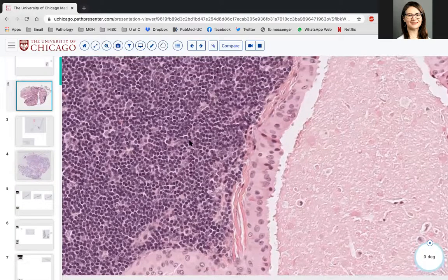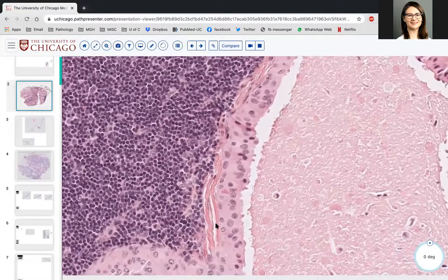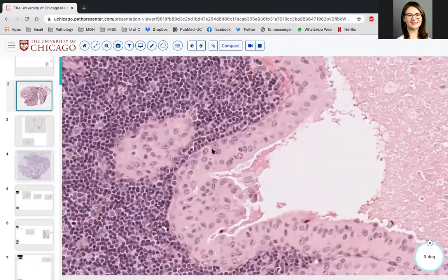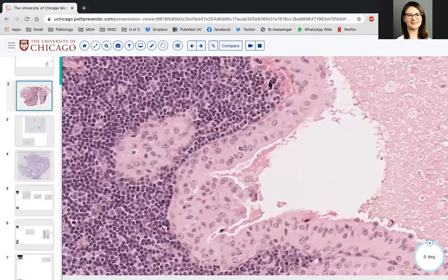But as you said, a nice background inflammatory infiltrate with very beautiful bilayered oncocytic cells with large nuclei, prominent nucleoli. I will mention immunohistochemically, if you were to evaluate this, sometimes this abluminal cell population out here does stain for P63. So even though it looks morphologically like a single cell type, you may actually get some P63 staining at the periphery of these nests.